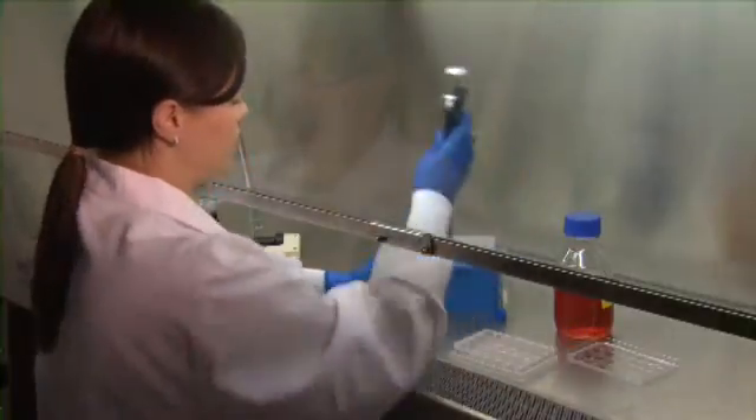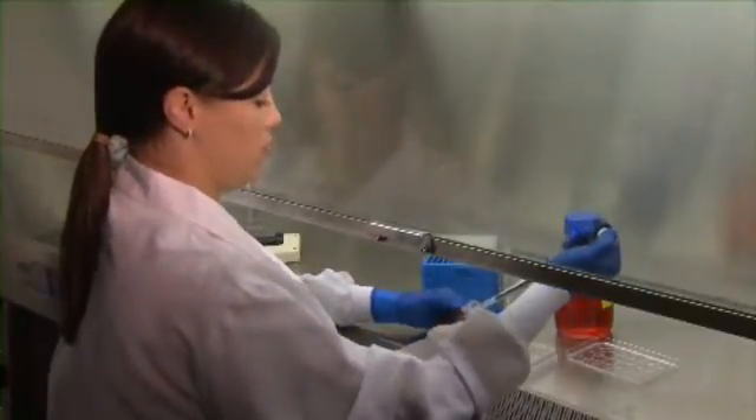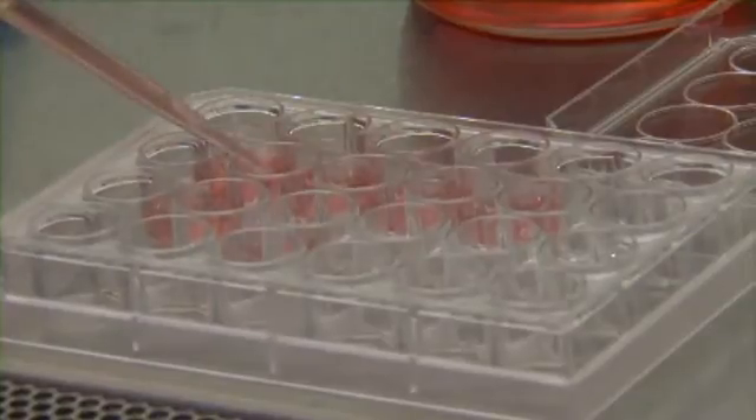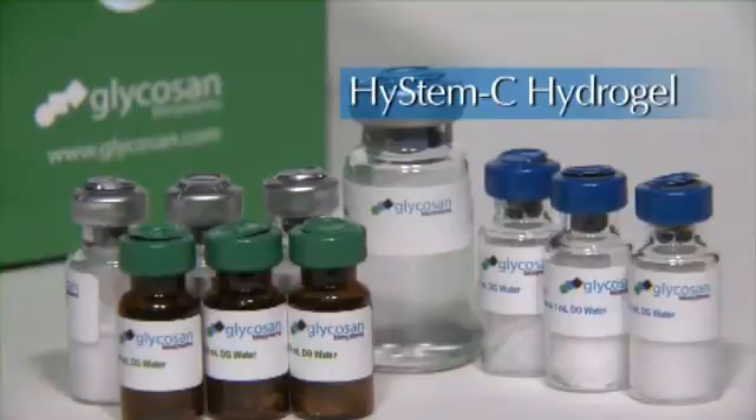Step 4: Now you can either add cells and media on top of the gel for 2D cell culture, or just add media on top if cells are encapsulated. This process describes the use of our standard HySTEM-C hydrogel.